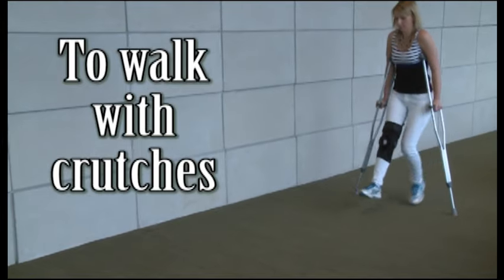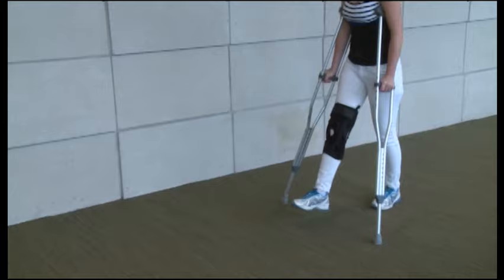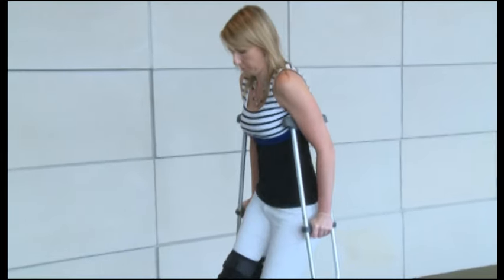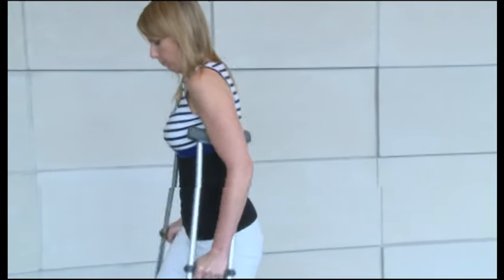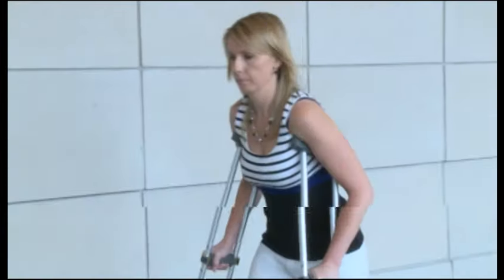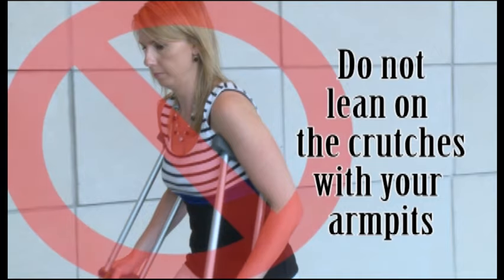To walk with crutches non-weight bearing, it is important that you keep the crutches under your arms and close to your sides. Squeeze the top of the crutches into your sides while putting weight on your hands and not through your armpits. Do not lean on the crutches with your armpits.